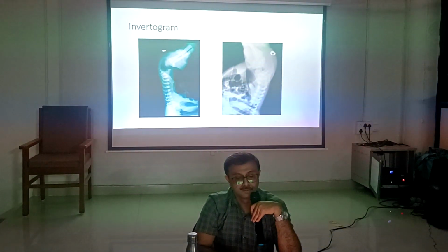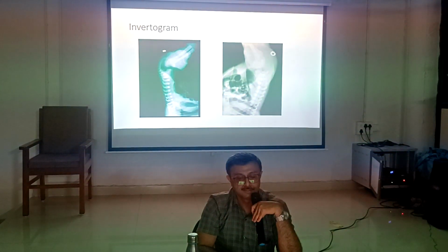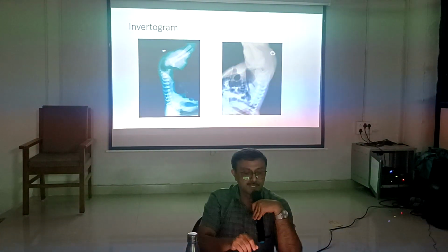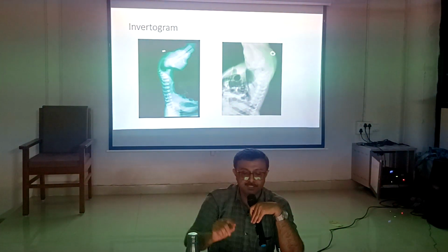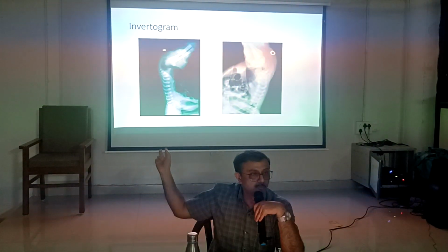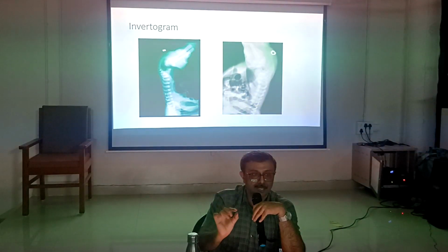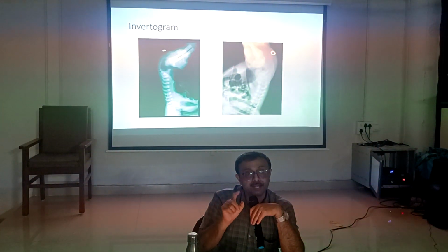Beautiful. These are various forms of invertogram. There are many varieties: low variety and high variety. This is a radio marker at the location of the anus. Anal dimple. If there is no anal opening, there is an anal dimple.